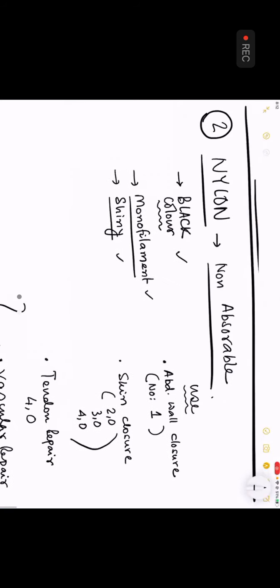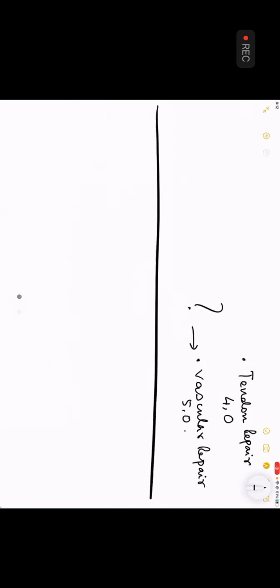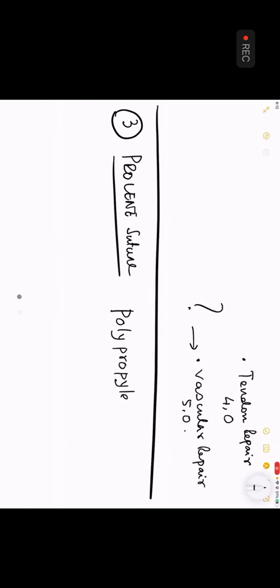Done, sir. Good. The next suture, which is non-absorbable, is called a Prolene suture. The name Prolene again is a trade name. The chemical name is polypropylene.